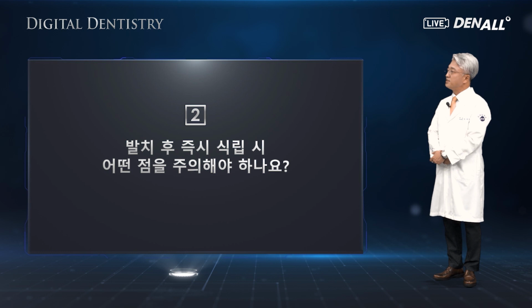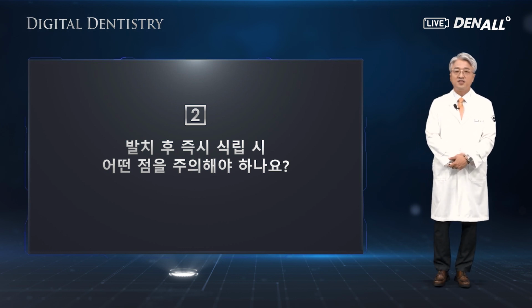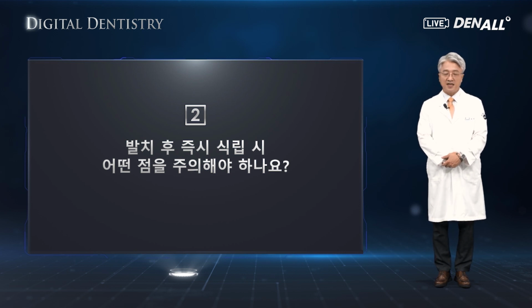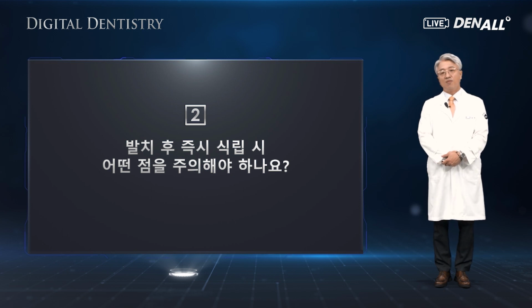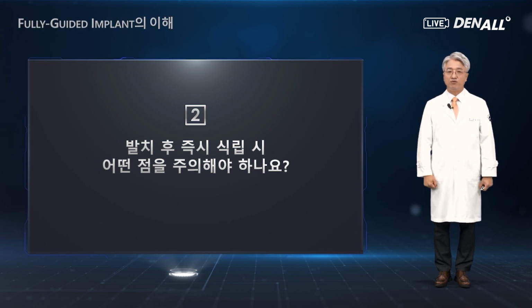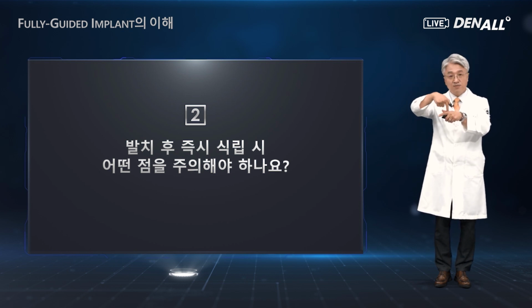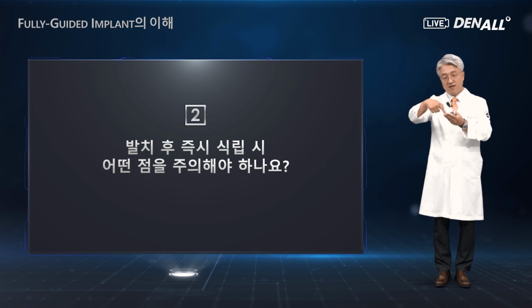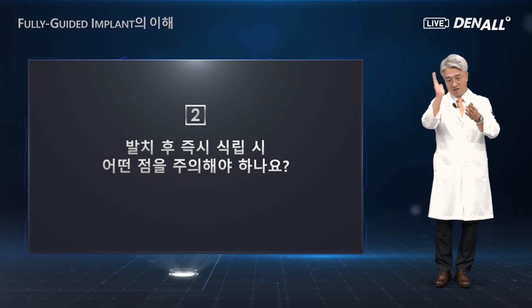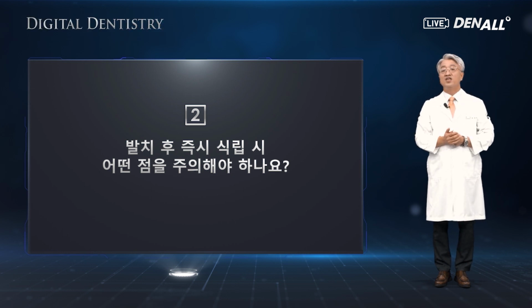Next, what should be the things we need to consider for immediate placement after extraction? This is one of the most challenging guided surgeries because there are irregular extraction sockets. We do the drilling through the guide, but when we do the drilling, depending on the shape, like a concave wall of the extraction socket, the drill can slip.